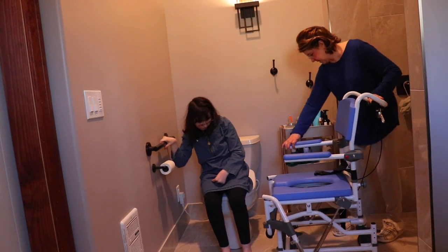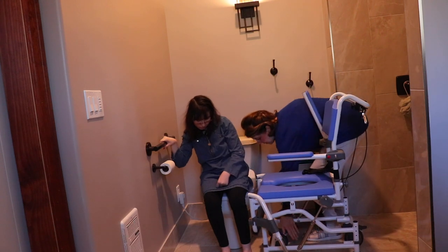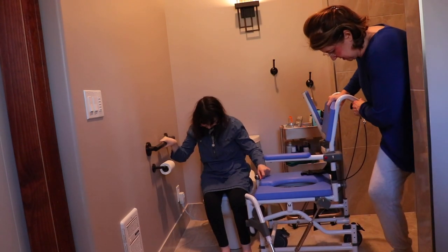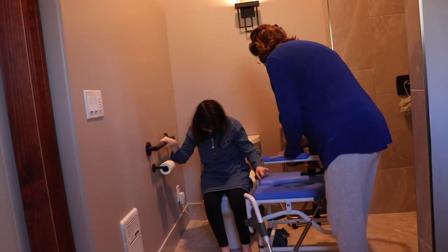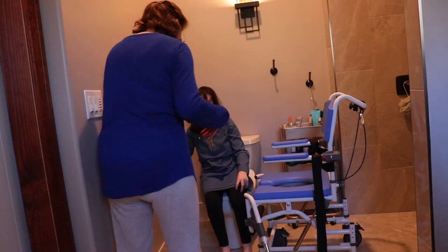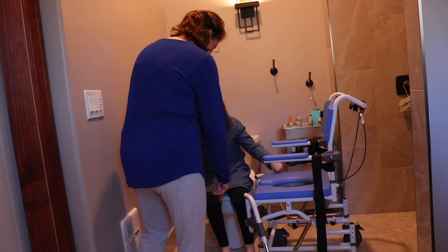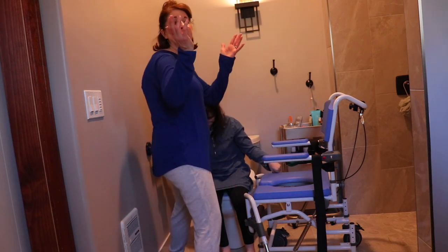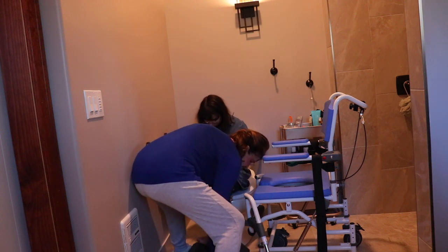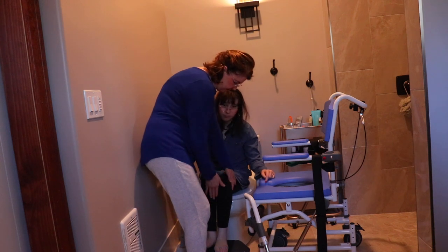I'm going to put the brakes on — I hate doing the brakes, and I hate listening to them; they're really hard to do and they're actually very loud. I normally put her feet up before bringing the chair up but I forgot this time, so we'll do it as we go. I lift up her legs — one two three — good job Anna! I lift up her legs and put them on the block, then scoot a little bit to make it easier for her to get up.